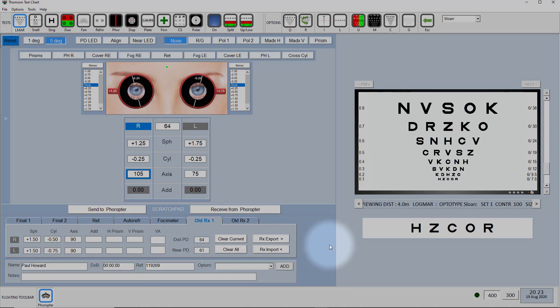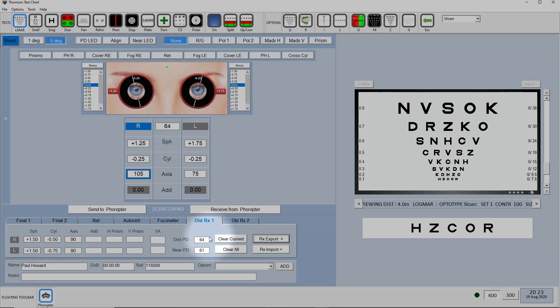Now to get that back into the patient management system you simply have to click on RX export and that will then export this new prescription including the final prescription into that intermediate file and you then click on import in your patient management system and this final prescription here will be imported into your patient record.